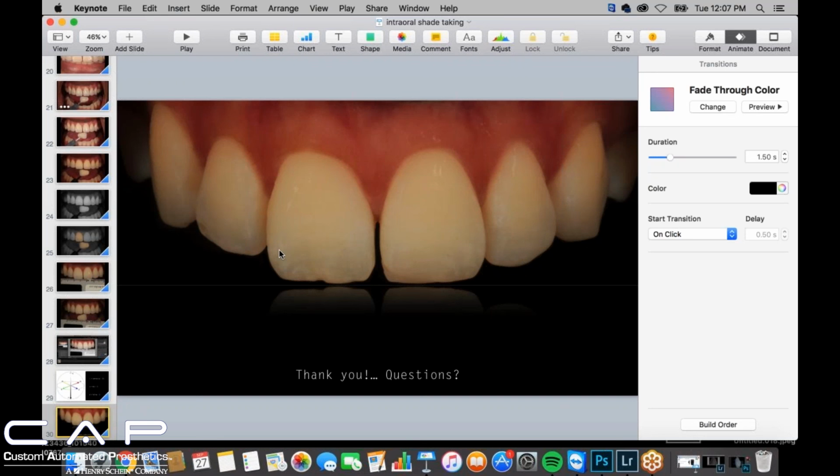Mario Ramiro asks, the last image shows a polarized photo. Do you think that it is always necessary to communicate with your lab? I don't think it's always necessary. This is a fairly new thing for me. I mentioned before my good friend and dentist, prosthodontist Miles Cohn, bought this polarized filter system probably a year ago, and I'm telling you, since he's been sending me photos of his patients with that, along with the more standard photos, it's been a huge help.